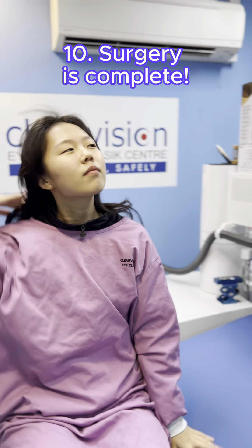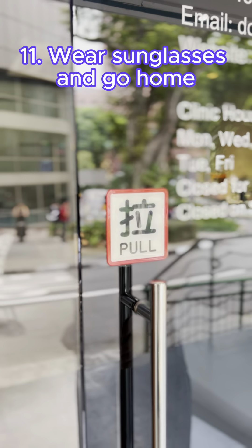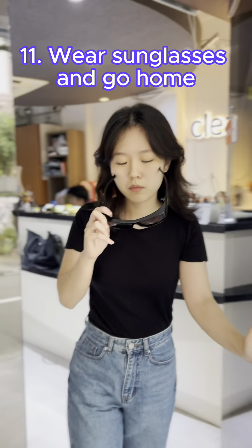Trans PRK surgery only takes 5 to 10 minutes. Say hello to your new eyes. Put on your protective sunglasses and go home to rest for the day.